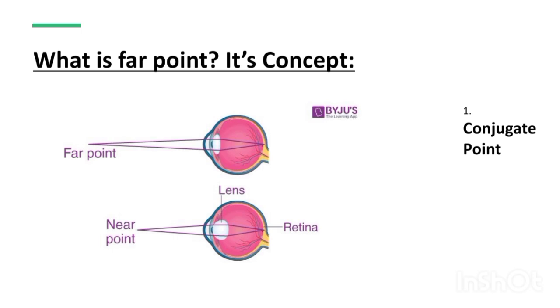So when we are doing retinoscopy, our sole purpose is to keep the patient's accommodation very, very relaxed. So, with accommodation relaxed, the maximum distance the patient can see clearly is the far point. And that far point should be conjugate with the fovea to get the exact, accurate refractive error of that patient. That is why the concept of the far point is important in retinoscopy.